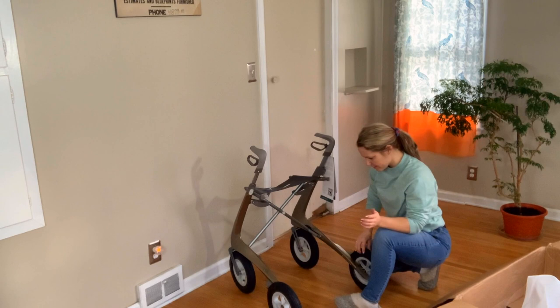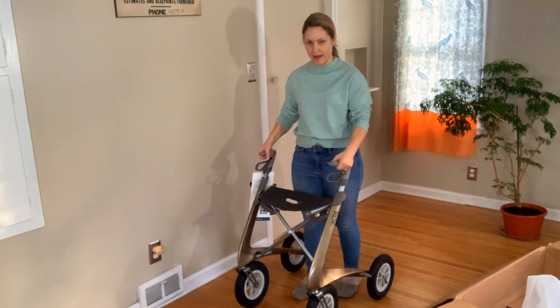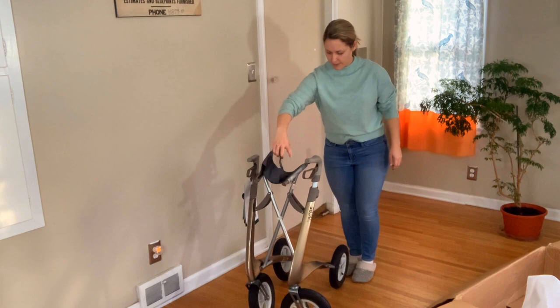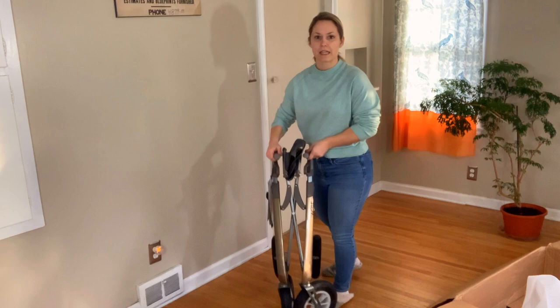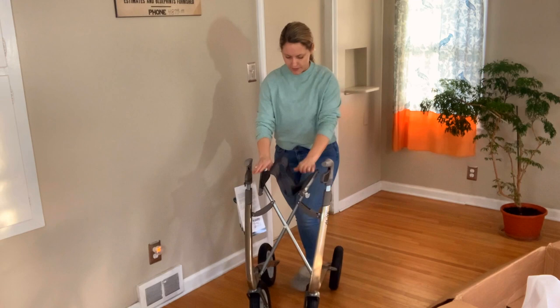I am loving this. This rollator definitely feels sturdy, which is why I'm surprised it's only 14.8 pounds. I can easily lift this up. I also can fold it — and look how narrow it gets. So this would be really easy to just lift and put into a car, into a plane if you're flying somewhere, or just store somewhere in your home. I love how thin it gets, and then it's really easy to open. Then you're ready to go.